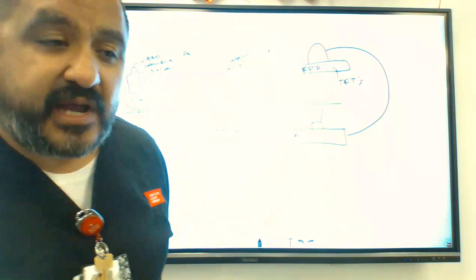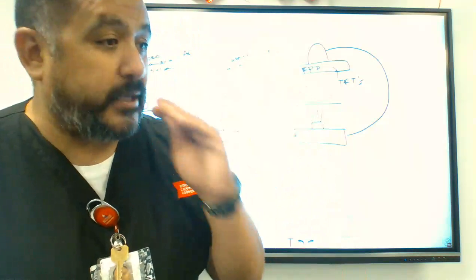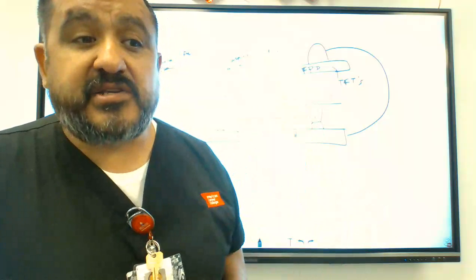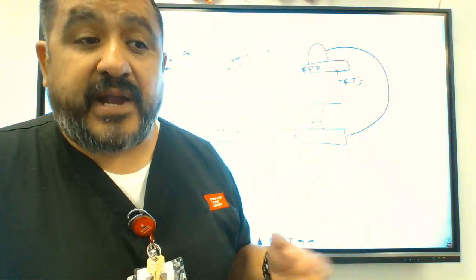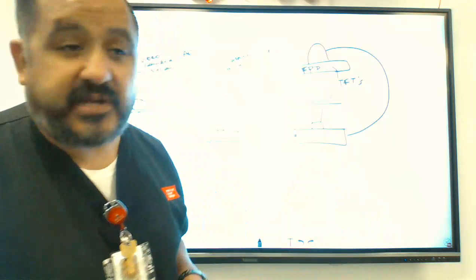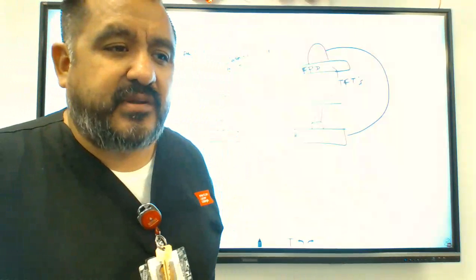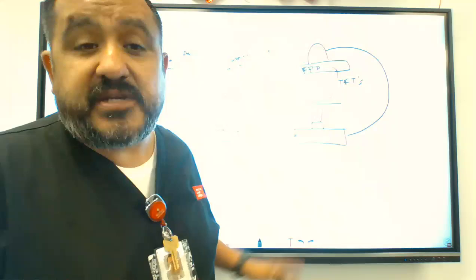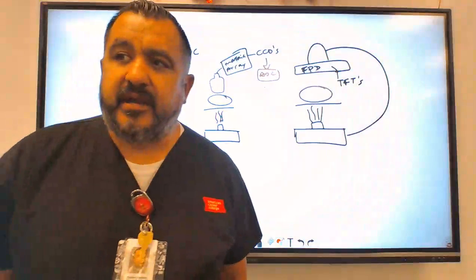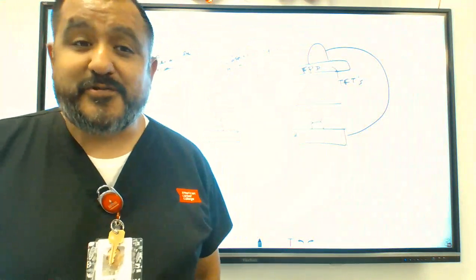They have what's called digital subtraction, where you can actually subtract various objects and only have, let's say you want to look at vessels, you want to get rid of the bone, the muscle, the fat. You can actually hit digital subtraction for vascular or arterial imaging, and you can see the vessels, all right, which is pretty cool. We had digital subtraction in MRI and in CT as well. So again, there's all these cool little features that we can utilize with fluoroscopy and technology now, especially with digital imaging. That formula on page 455, you guys can go ahead and go over that, and I'll talk about it in image production a little bit here, all right, because it affects resolution.